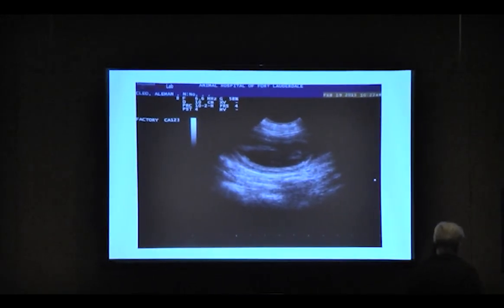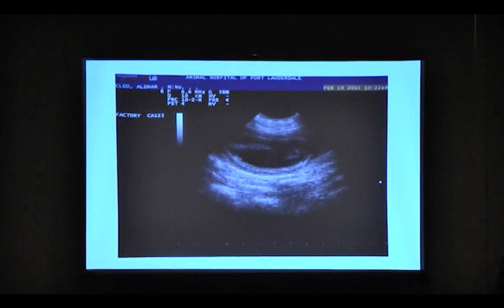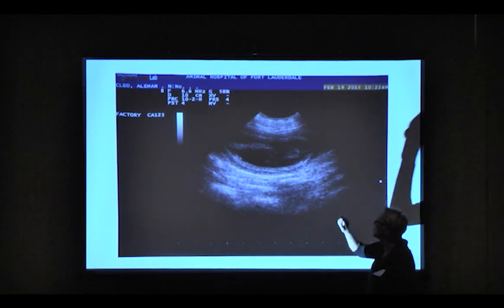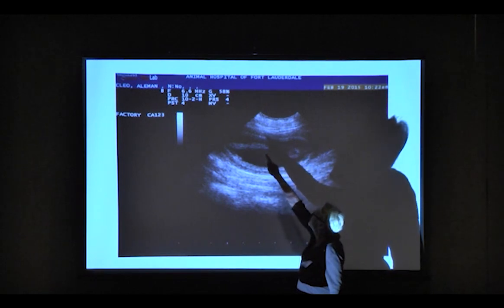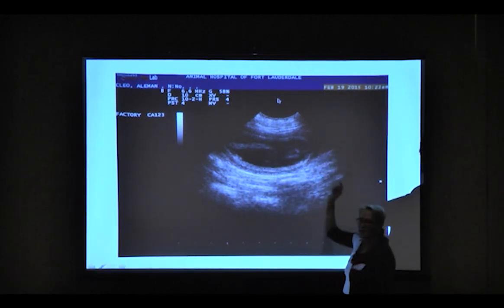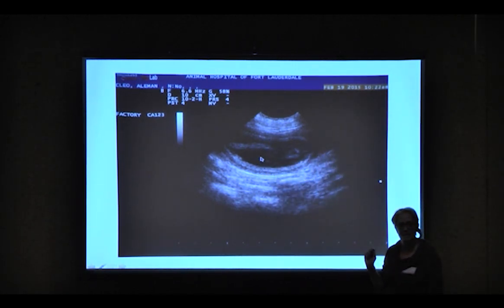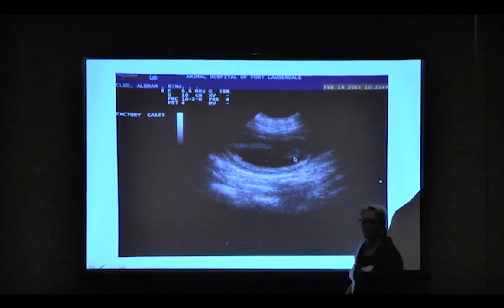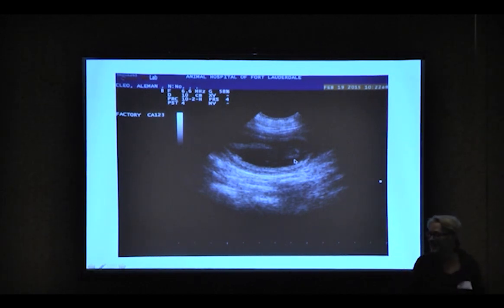Okay, here is an ultrasound of a pregnant bitch. This is a 19-day bitch, just to show you that you can do it. There is the placenta, and that little thing in there is the puppy. That's what it looks like, and that's when I confirm pregnancy. I usually bring them back a week later because I like to see heartbeats.